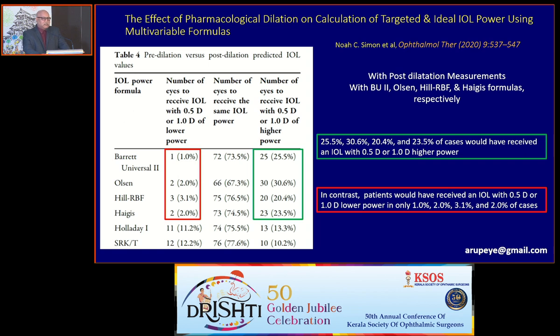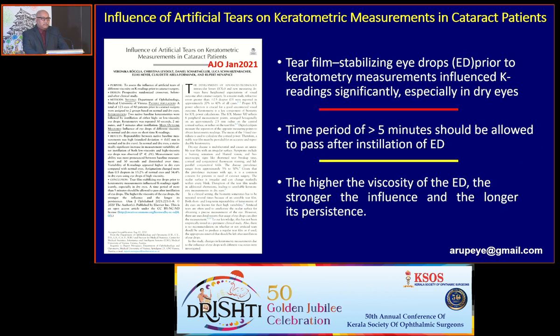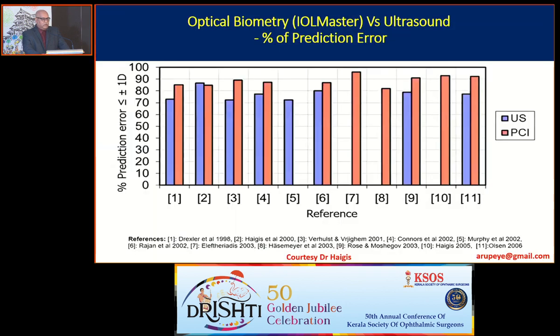So this has to be discussed with the patient when you take the consent from the patient. Sometimes we use tear substitutes before biometry. In case you do that, please wait for at least 5 minutes before you do the keratometry for those patients.